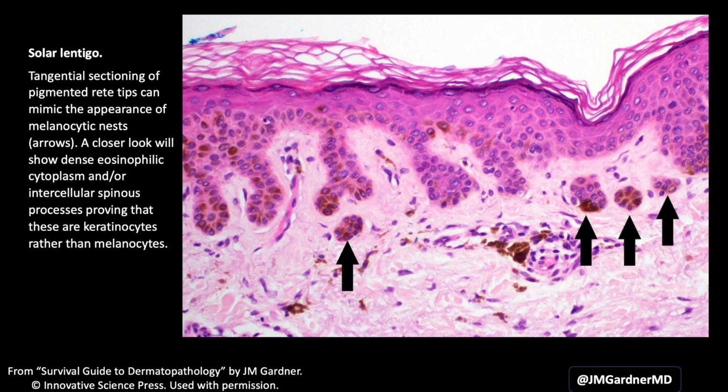Now, I want to also point out that lentigo maligna doesn't have anything to do microscopically with solar lentigo. Clinically, lentigo maligna, which is melanoma in situ, or it can be invasive also, can look like a lentigo, which is where historically this name came from. But I have sometimes found pathologists and trainees who have been confused by that.